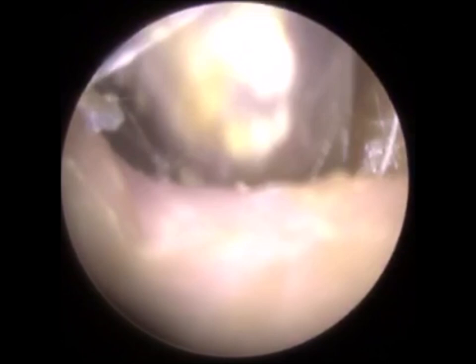So I'm just working on his original ear canal here. This is the front part of his original ear canal, and to the left is his mastoid cavity. If you didn't have the mastoid cavity, this area here would be his original ear canal. You can see at the top, beyond this piece of skin, it was a bit damp and wet, because of the humidity. And over time, this dead skin can get infected.